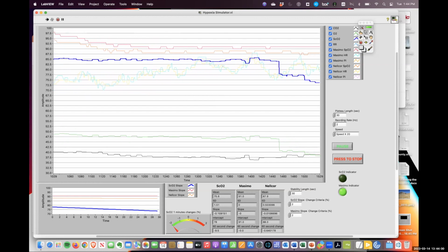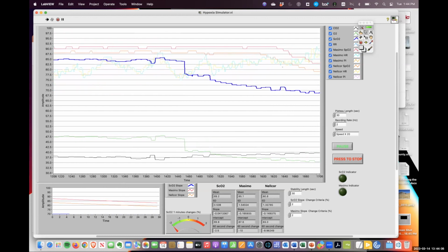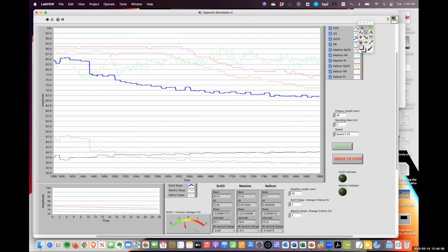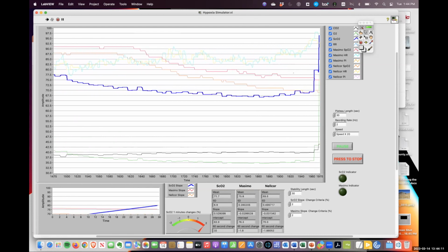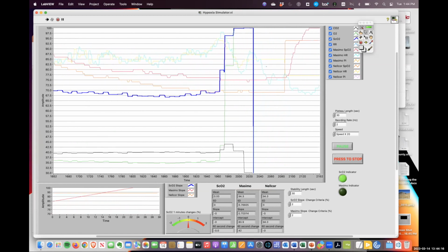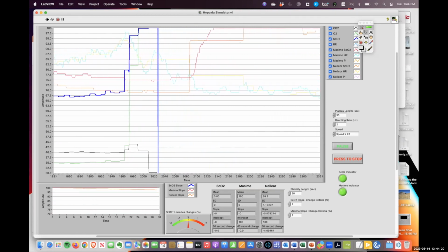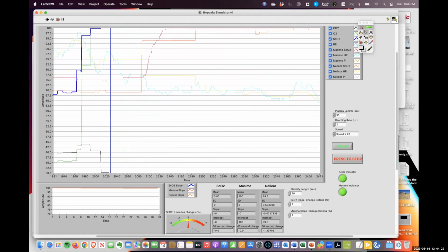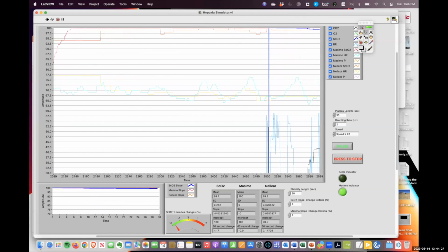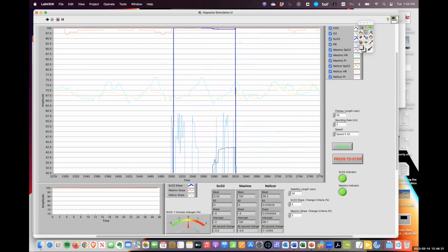This is probably, the heart rate probably correlates with what Paul was saying about people's breathing response. Look how long it takes for this to come down. So this is a good example of a very, very challenging study with low perfusion where we have to wait a lot longer. Notice the heart rate comes down here immediately, and look again how long it takes for resaturation, but the heart rate is transduced immediately. So when we give oxygen back, people with high heart rates, the heart rate will plummet immediately even while the saturation takes time to catch up.